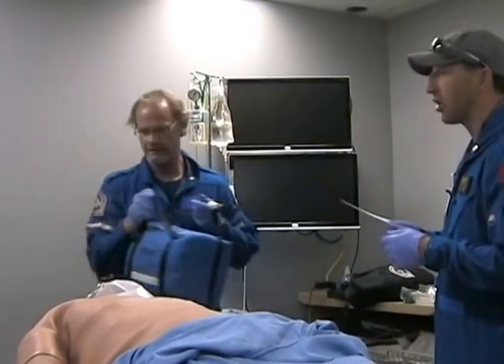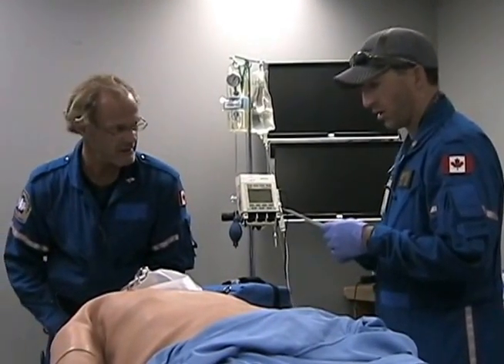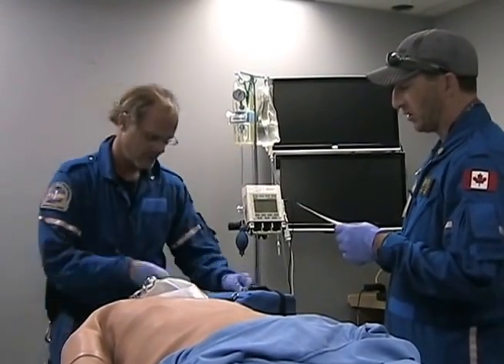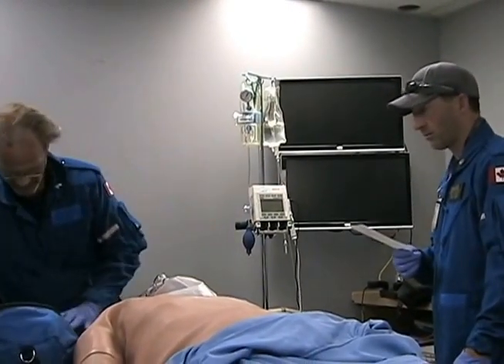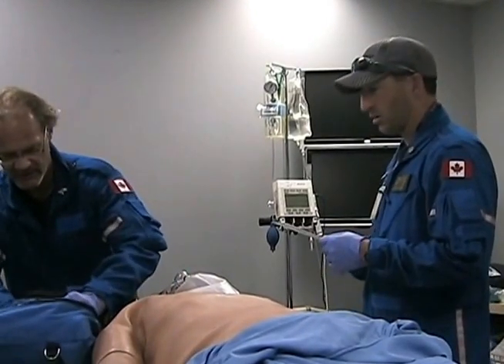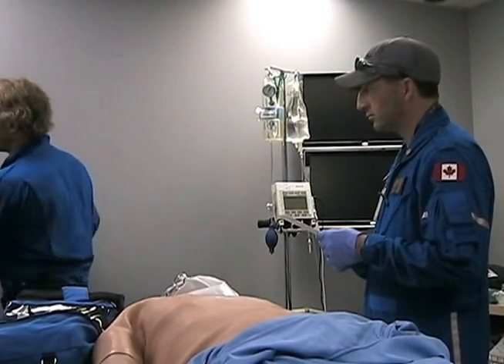So, patient position optimized. Okay, hold on a second. No C-spine precautions, right? No C-spine precautions. Okay. Nasal prongs at 15 liters. Okay, hold on, I just got to open my bag. Oh, okay, I'll get that. Sure. Prongs out. I may have to have you hand some of this stuff to you. Okay, do it, sure. But I'll do the prongs. Okay, hold on. Okay.